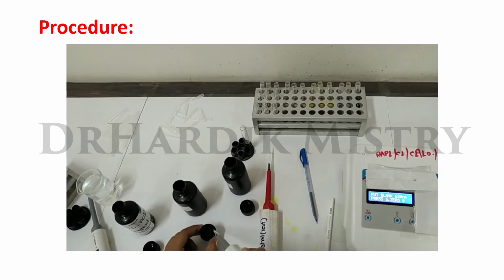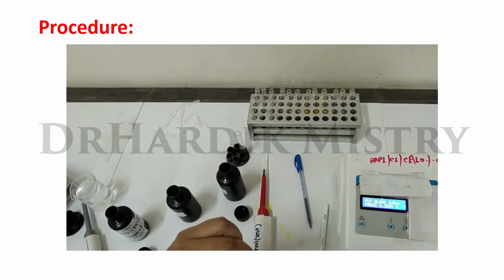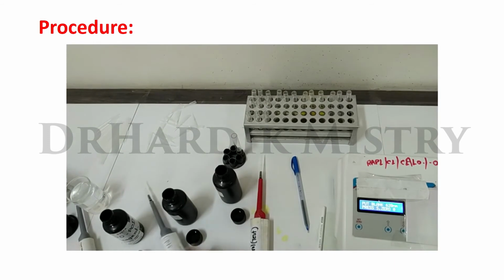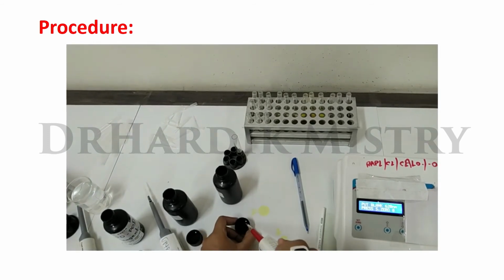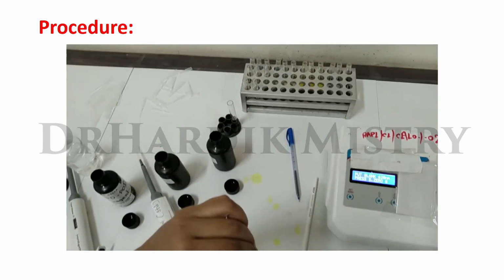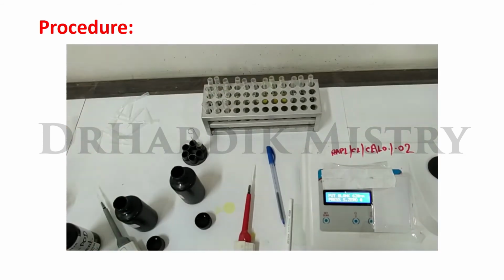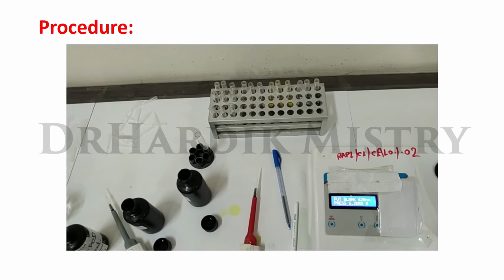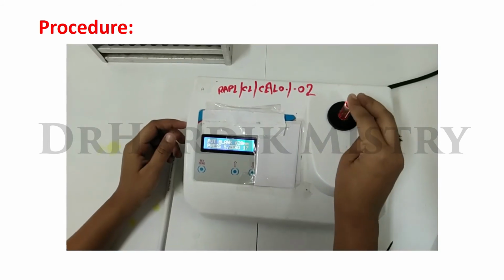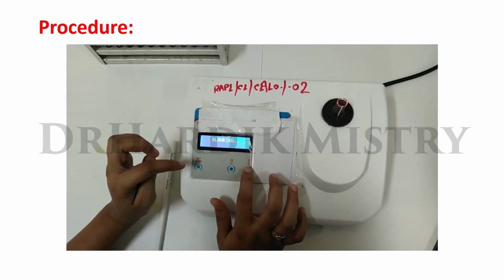Add 10 microliter of standard in the standard test tube. Add 10 microliter of sample in the test tube. Mix well all 3 test tubes and incubate at room temperature for 5 minutes. After 5 minutes, read absorbance at wavelength of 520 nanometer colorimetrically. Now take your readings.